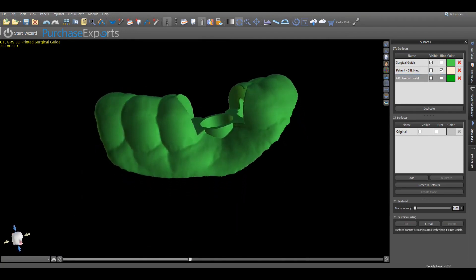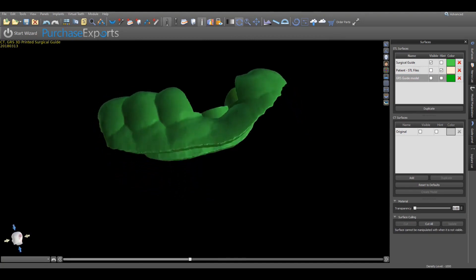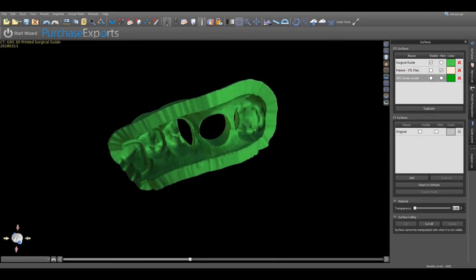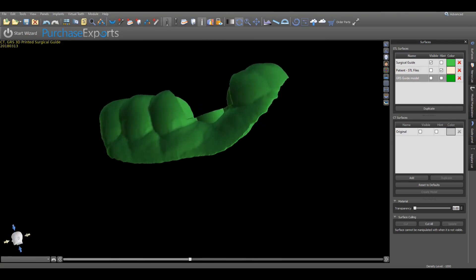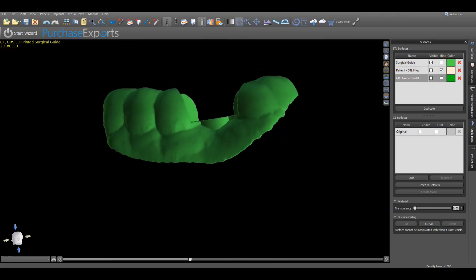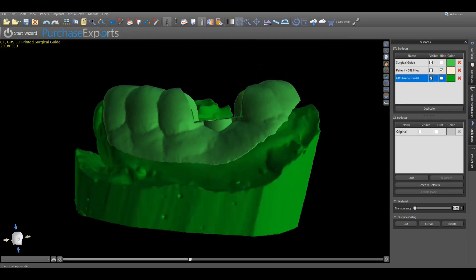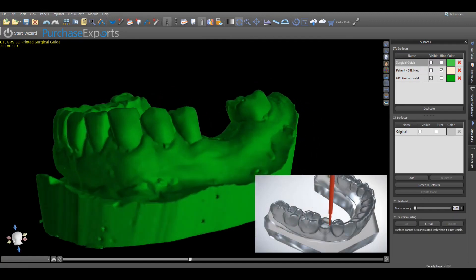Once the surgical guide and model have been 3D printed, make sure to seat the guide on the model and make all necessary adjustments to ensure a stable and comfortable fit. After confirming the fit, insert the proper GRS surgical ring into the surgical guide and affix with the medical grade adhesive.